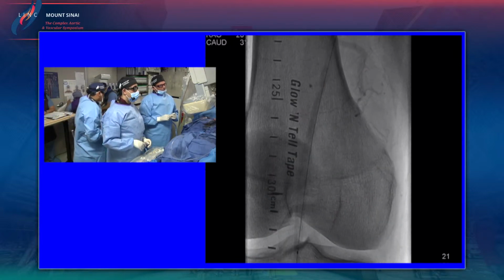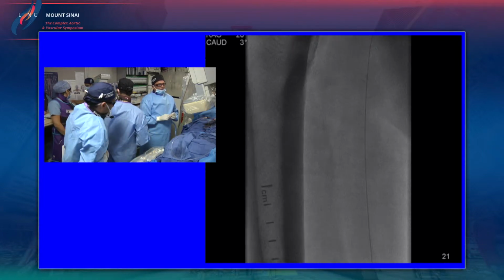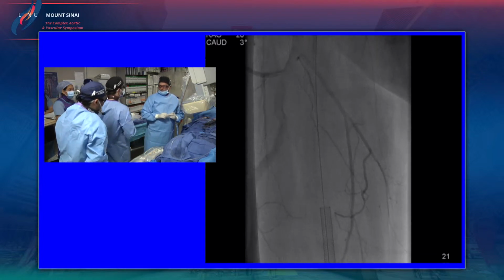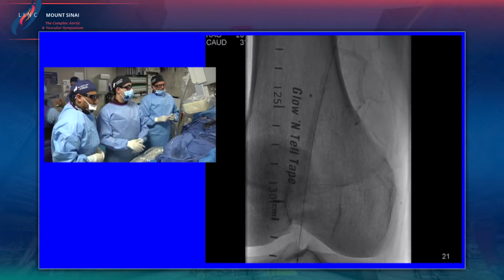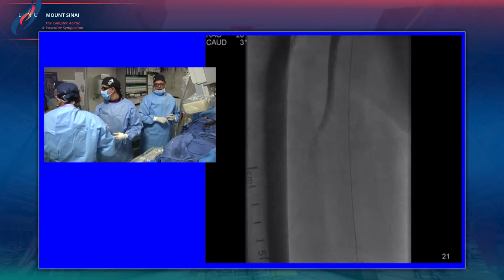How far will you go down, PK, do you think, with your Zilver? Where do you start? I think we're going to start around 25 to 26, right? That's what we were told. And I think we're going to start at that stage, Chris, and you have that competitive flow around 25, 26. And then we're going to go ahead and decide how this looks after the Zilver.